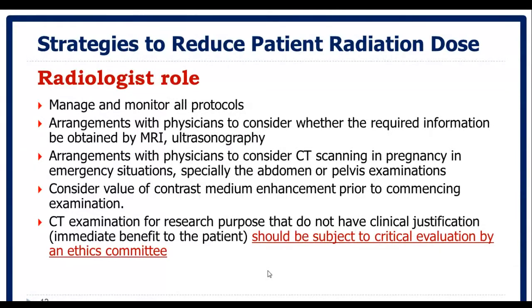Okay. Also, the radiologist needs to consider the value of contrast medium enhancement before commencing the exam, because if we need to inject contrast media, we may need to scan the patient pre and post contrast, and this will induce more radiation to the patient.